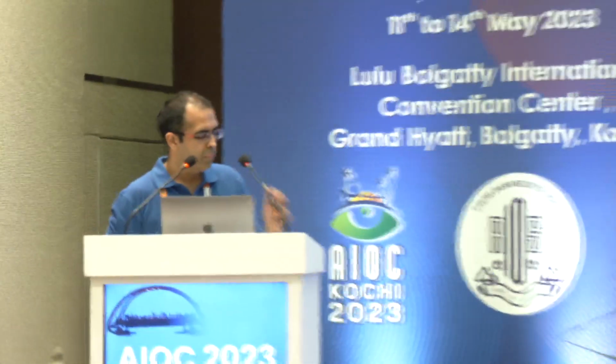See, in retina, there are some disease entities like myopic traction maculopathy, lamellar hole, pseudo hole, which we cannot diagnose without OCT. Yes, sir. Just for my information, is there any disease entity in cornea which you cannot diagnose without anterior segment OCT?